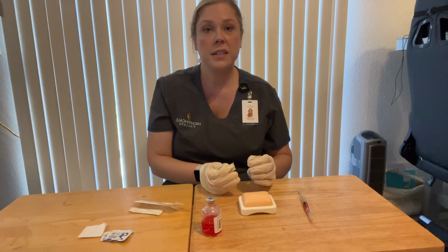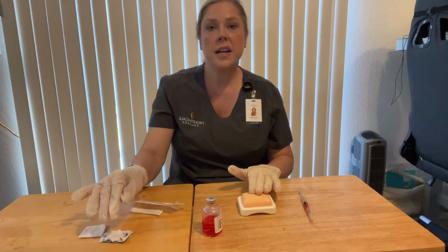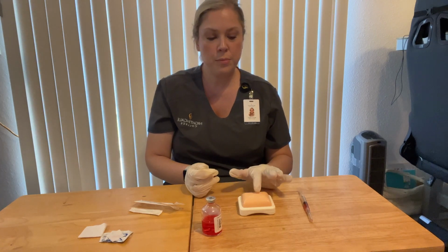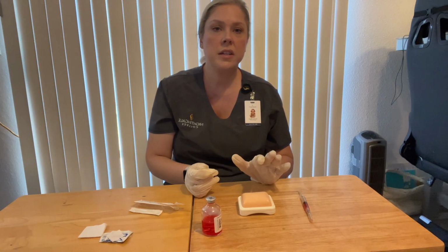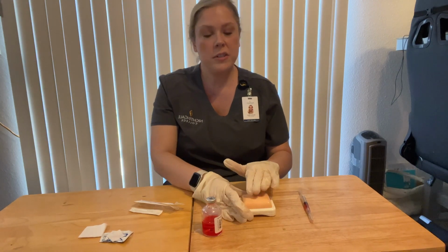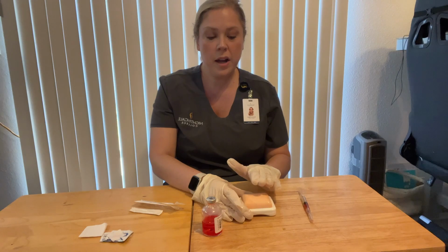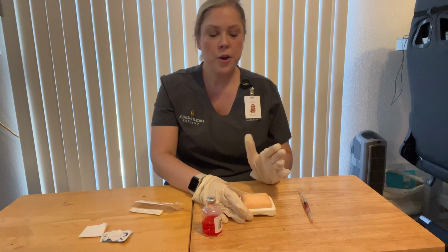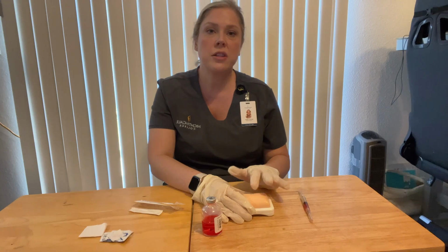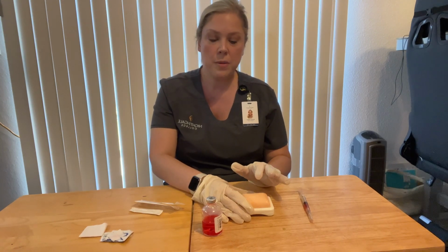Before we actually clean our site, we're going to inspect the site first for muscle size and integrity. Also, we want to assess for any bruising, skin irritation, and any edema. We'd also want to palpate for tenderness or any hardness. And if there were any irregularities, we would avoid the area and then we'd find a new one. And we also want to make sure that Mr. Smith hasn't had any injections in that site recently as well.